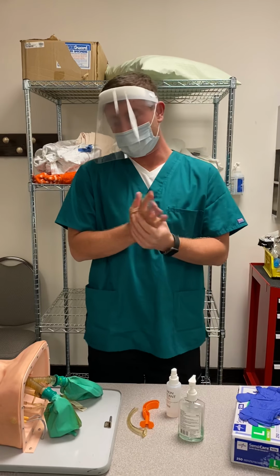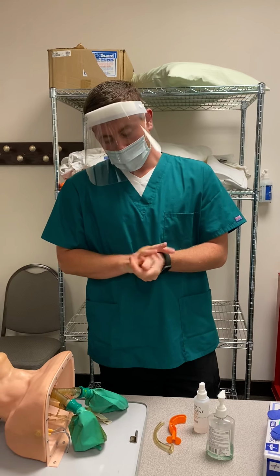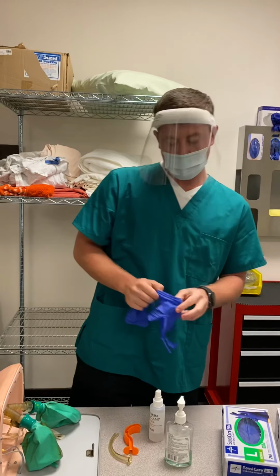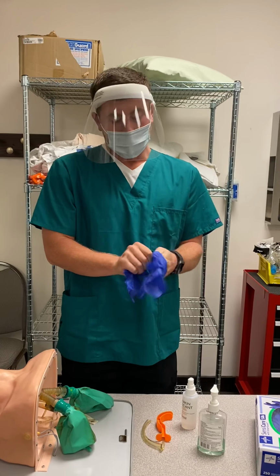As I'm doing the oropharyngeal airway first, it is noted that the oropharyngeal airway is only used on unconscious patients to secure the airway and keep the tongue out of the way of the airway.